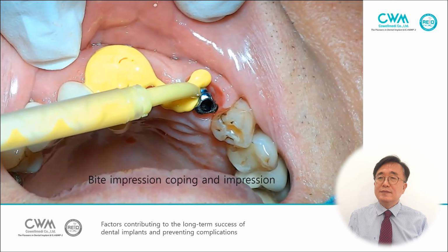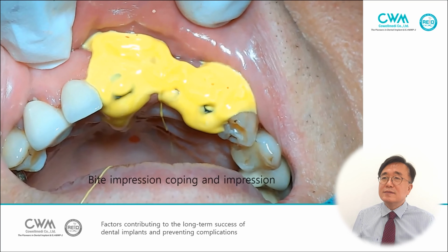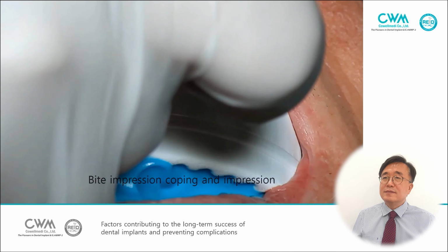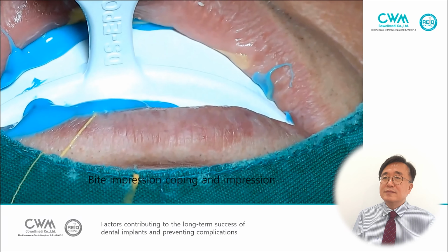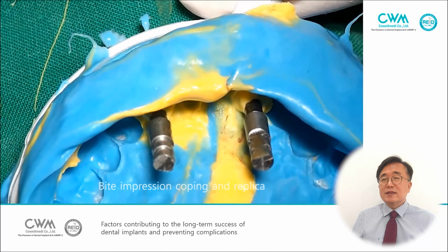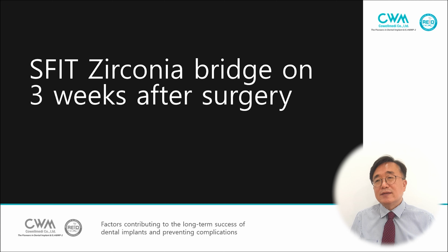By the impression, and the impression coping is connected to a replica, and this assembly is inserted into the impression.